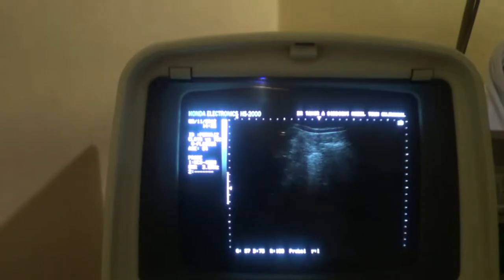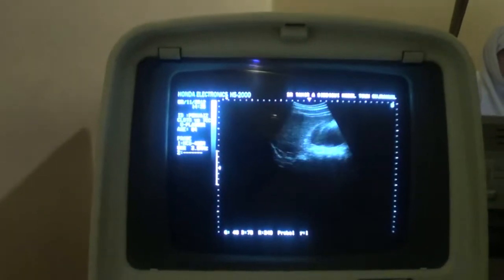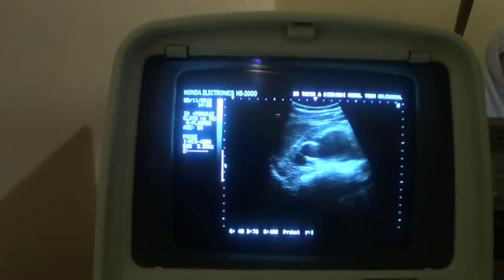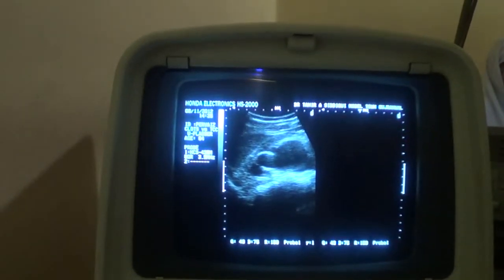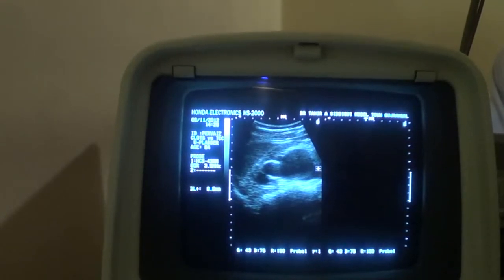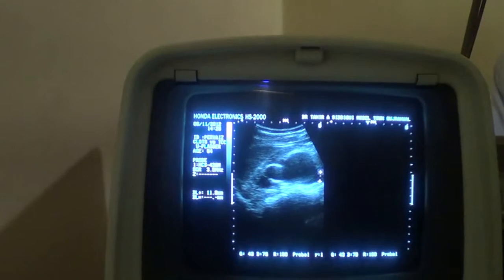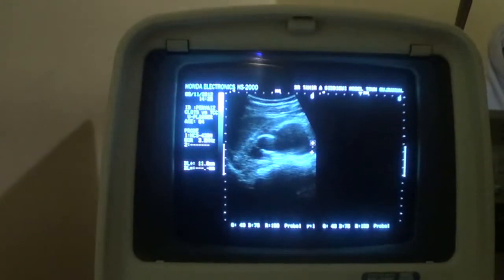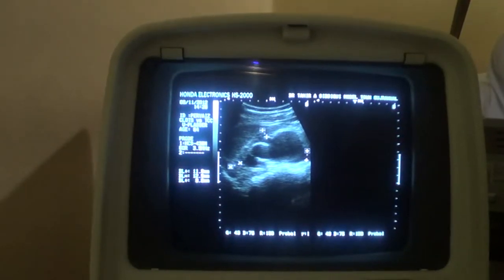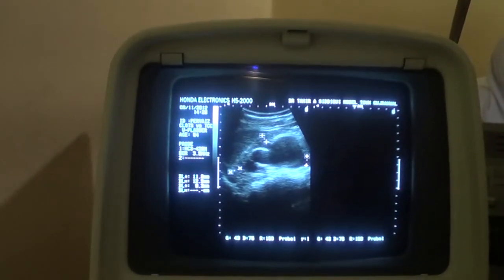Now let's see, is there any mass effect on the kidney? This is the right kidney in longitudinal section, and you can see that all the calyces are dilated, moderate to massively, in a sense that this is hydronephrosis. This is the proximal ureter dilated up to 11.8, which should not exceed 7. So dilated proximal ureter and relatively thinned out parenchyma, as you see that the parenchymal thickness at the upper pole is 12.5, at the mid region approximately 9.3, and the distinction between the medulla and the cortex is almost muffled.